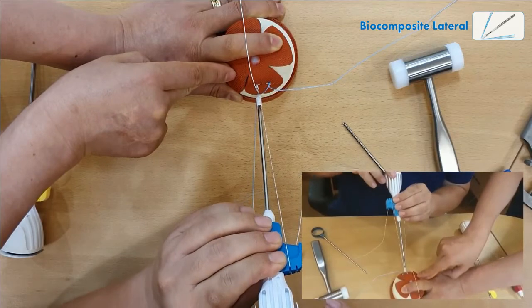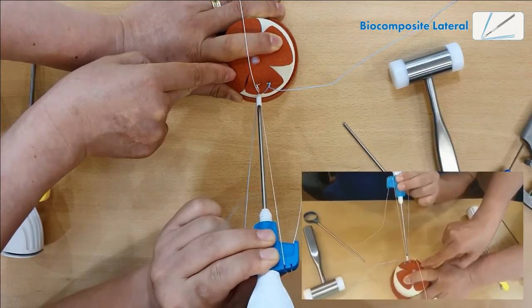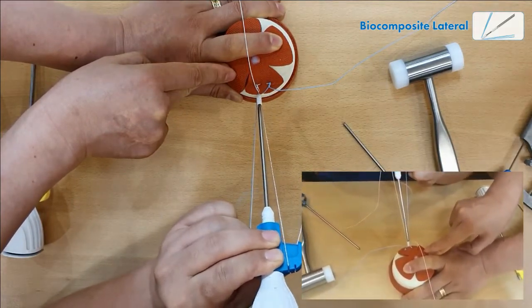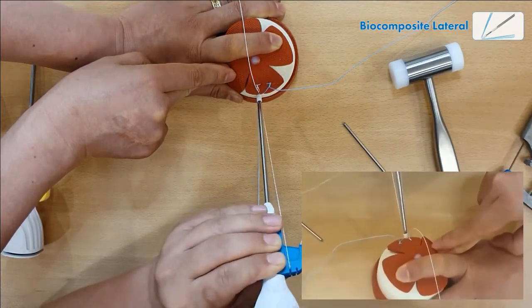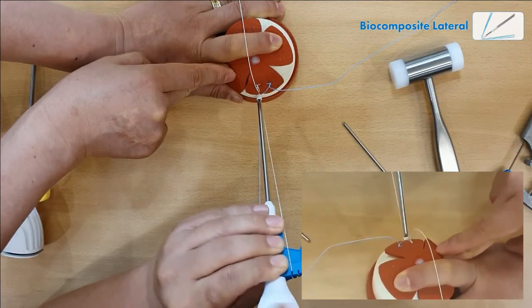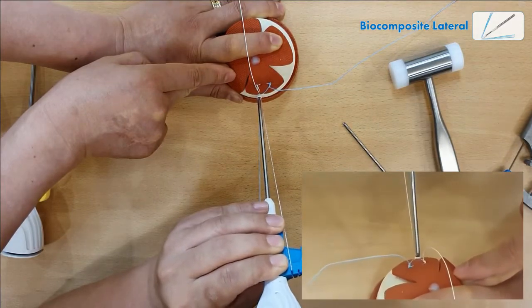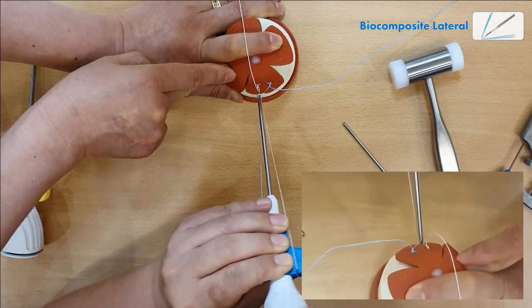It's going to keep the tension for the suture. Now, you just screw it. It will go in without any twisting of fiber wires or any more tension than you have desired.